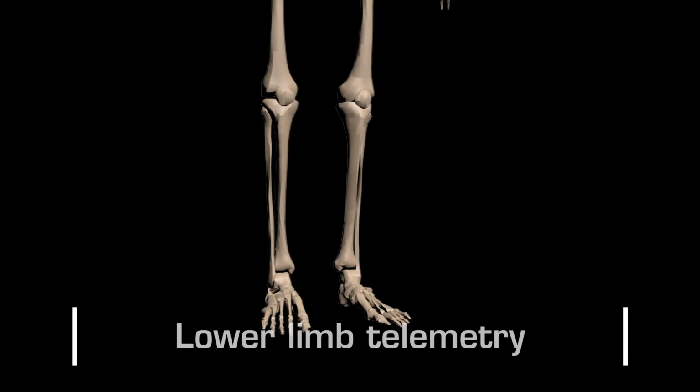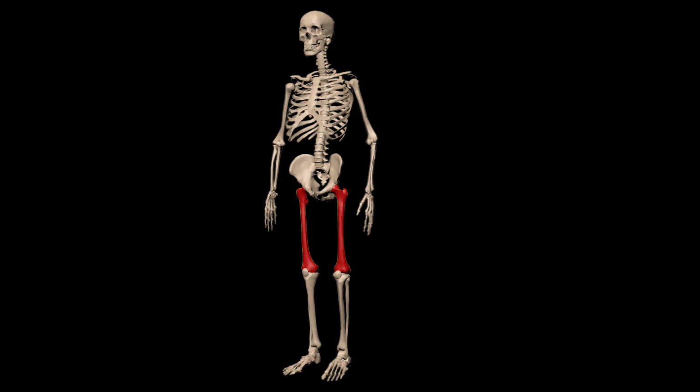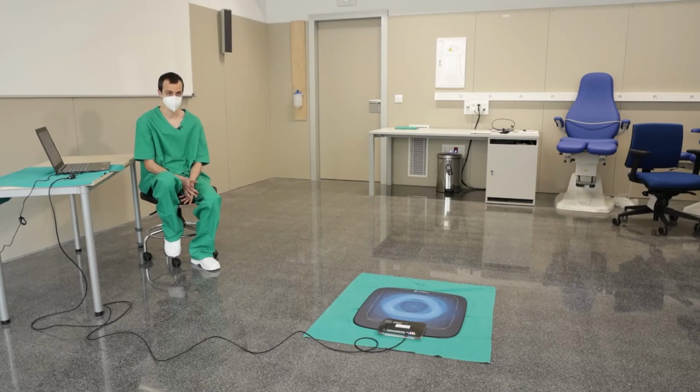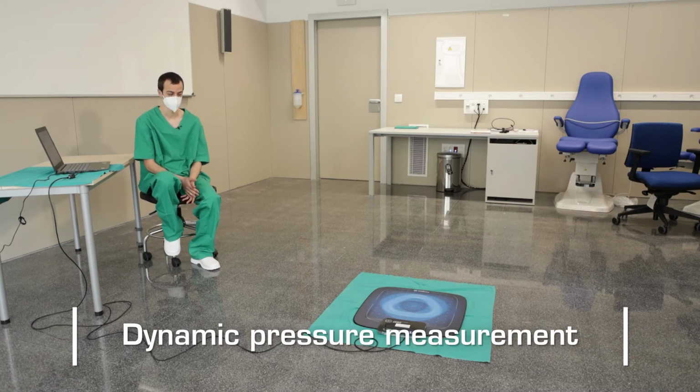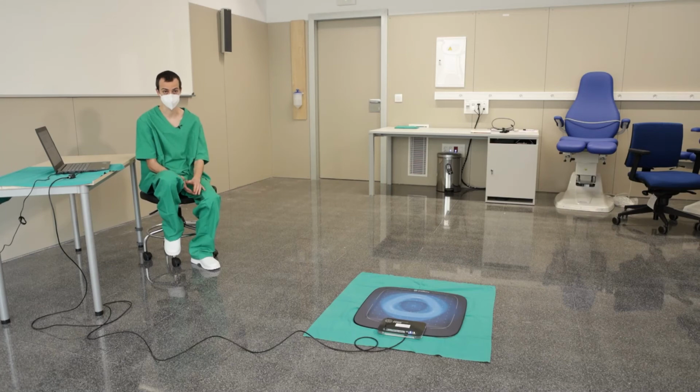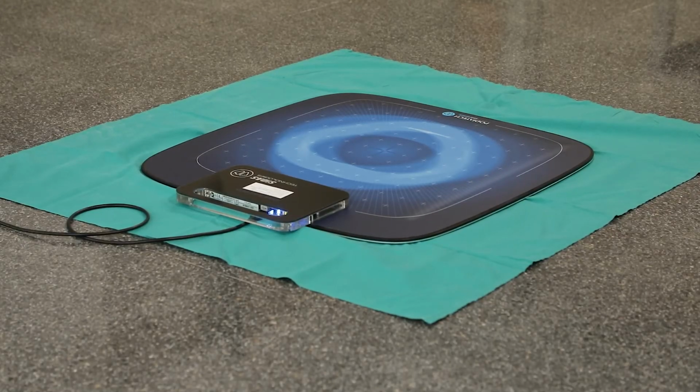The lower limb telemetry is a standing X-ray that ranges from ankles to hips and allows us to measure bone length accurately. For dynamic pressure measurement, we will obtain a video, not a photo like in statics. So we will simply ask the patient to walk and put one foot or the other one on the platform as if she were walking in the street.